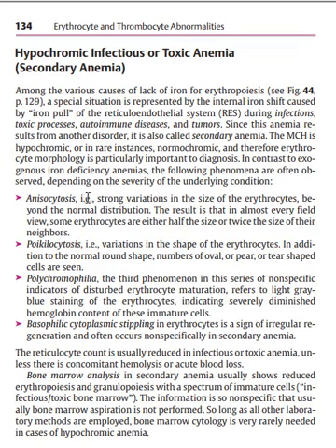Here you can have anisocytosis. Anisocytosis is a strong variation in the size of the erythrocytes, beyond the normal distribution. The result is that in almost every field of view, some erythrocytes are either half the size or twice the size.